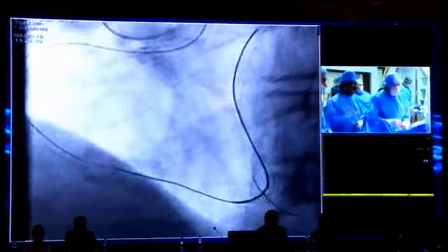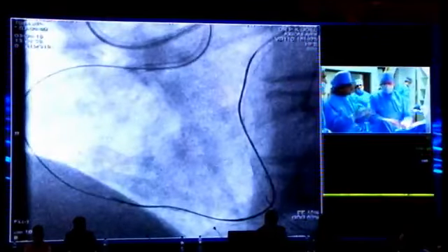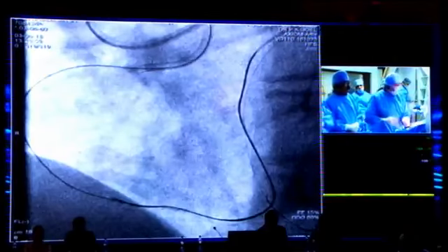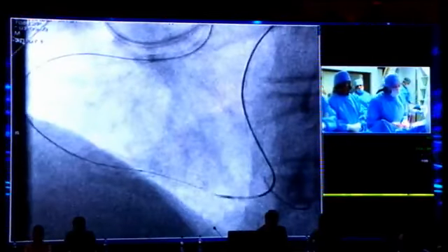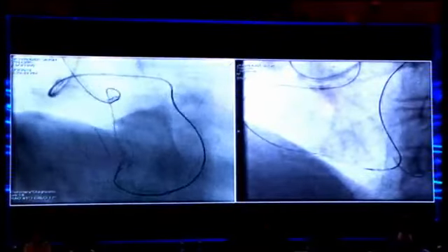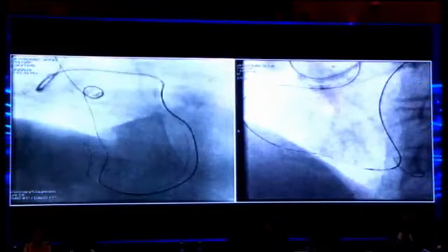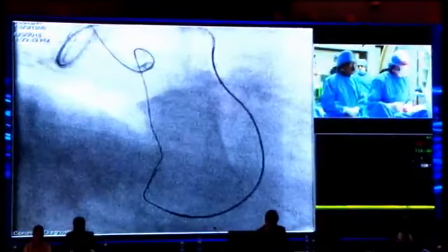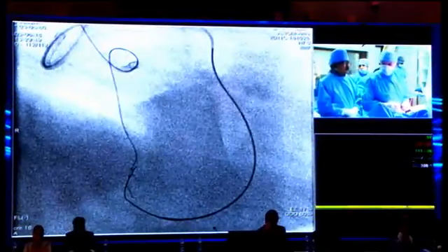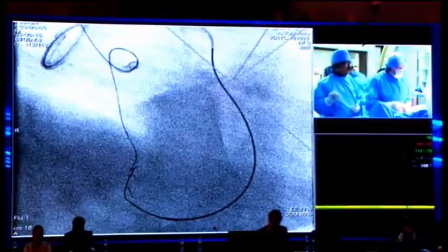And the moment it grabs the tissue, it means it goes straight, and that's where it moves. We check in the other plane because we should never be too sure. I'm sure. It goes a little bit outside here, but we can bring the antegrade balloon now, create some space for the retrograde passage. Okay, so you can go to the other lab. Please work on that reverse CART. We'll prepare for the balloon and stuff.